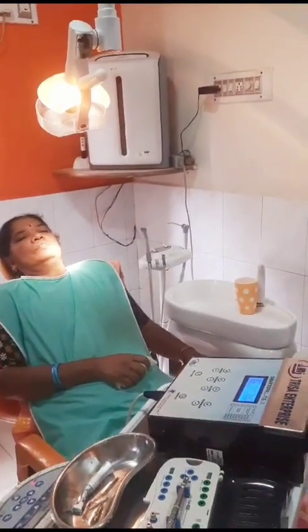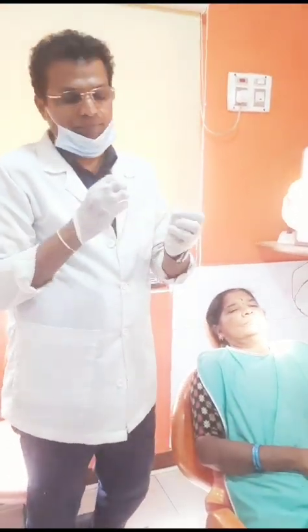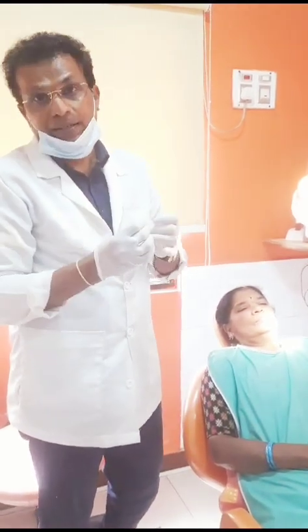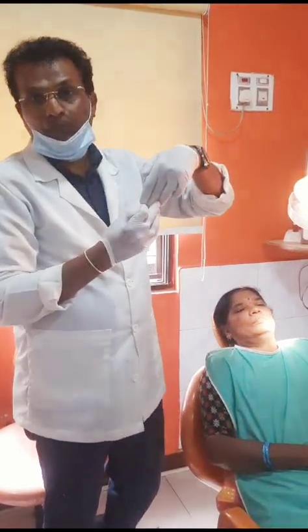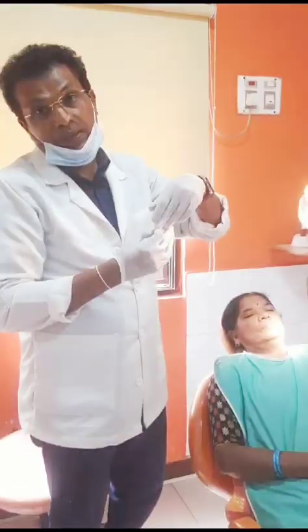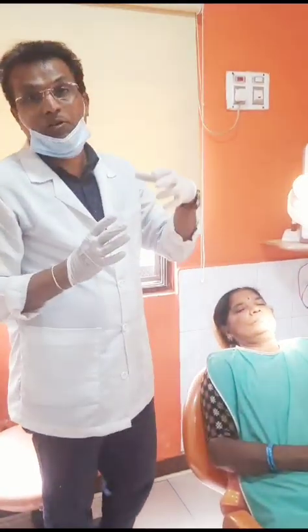She didn't want to go for crown cutting, so she preferred teeth mounted on the implants. The implants are placed in the bone — specifically in the cortical bone. These are not compressed implants or conventional implants; these are basal cortical implants.